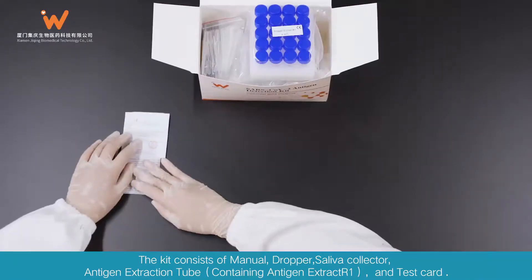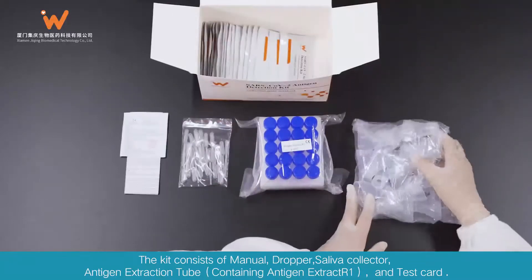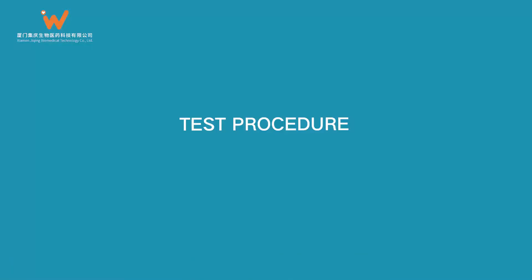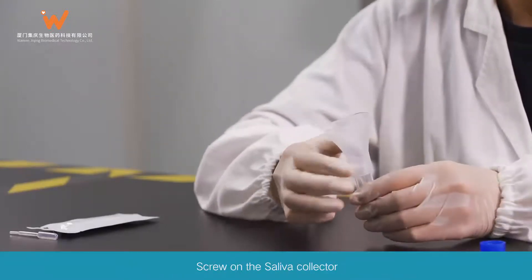The kit consists of a manual, dropper, antigen extraction tube containing antigen extract R1, saliva collector, and test card. To begin the test procedure, take out the antigen extraction tube, unscrew the cap, and screw on the saliva collector.